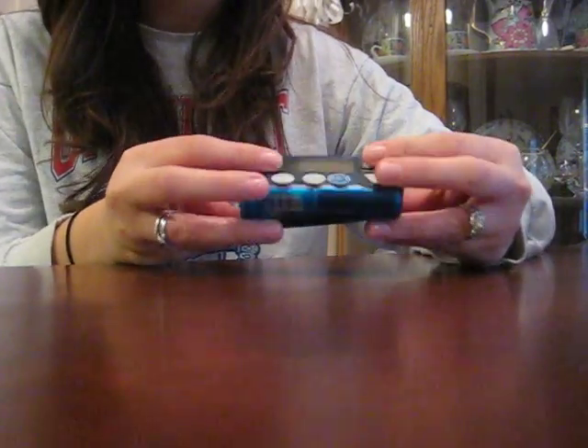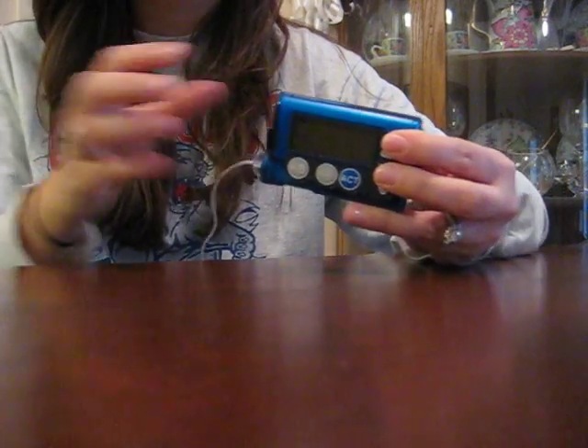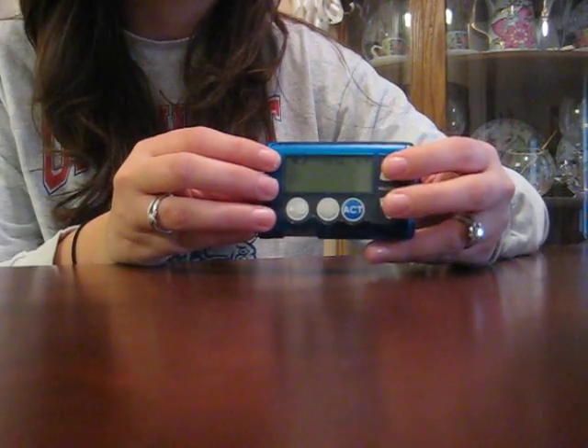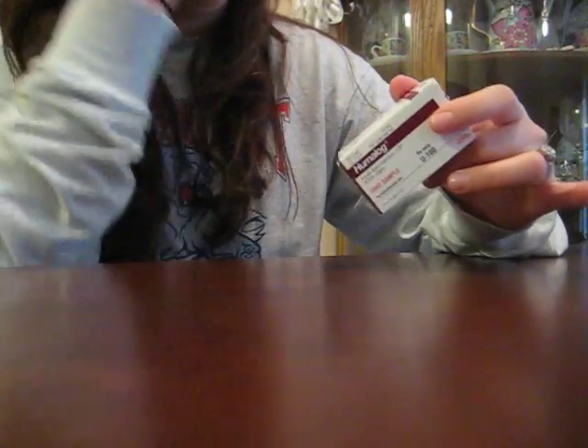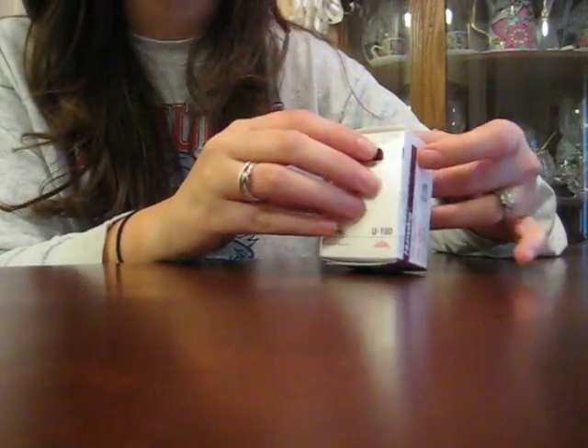Hey, I thought I would do a quick video about how to change out an insulin pump, just for people who are kind of confused. This is my insulin pump — it's connected to me right now — and some people are sometimes confused about how it works, so I thought I'd do a quick video to show you how. There are three pretty much aspects or components of changing out an insulin pump.